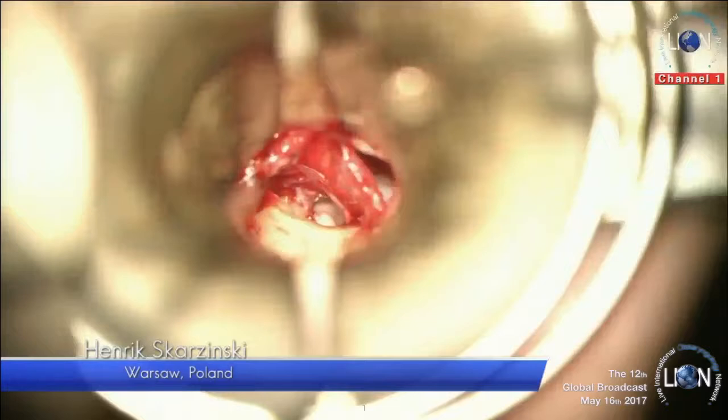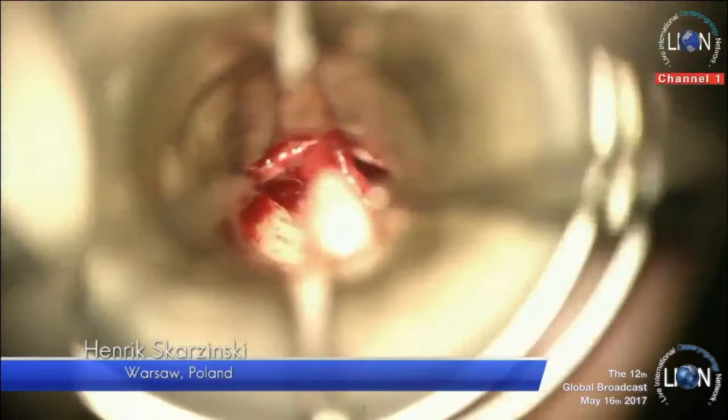Thank you very much to Monika for the presentation. I'm Peter. Together with Professor Henrik, we are performing the surgery now. We had a little bit of bleeding. It was really at the beginning, as Monika mentioned, the retraction pocket, which was really significant.